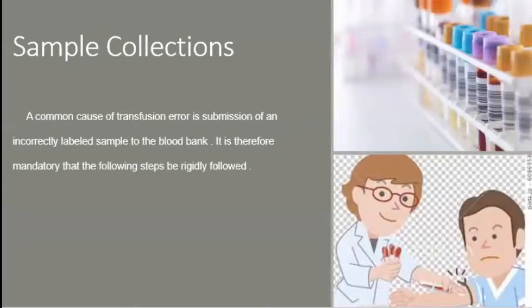A common cause of transfusion error is a submission of an incorrectly labeled sample to the blood bank or transfusion medicine. It is therefore mandatory. I don't like necessarily using that word, but it would be helpful that the following steps be rigorously followed.